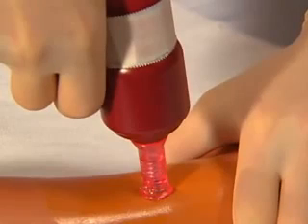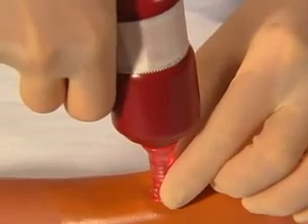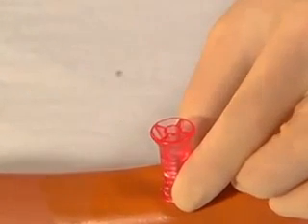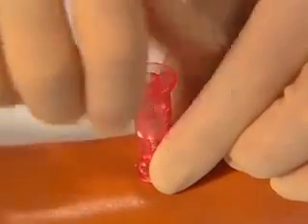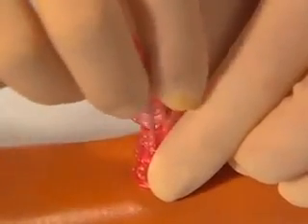Once resistance decreases, marking the entrance into the medullary cavity, take care to release the trigger and allow the driver to stop spinning before pulling back or disconnecting the needle. Gently hold the needle and pull the drill directly backward and off the needle to disconnect. Turn the stylet counterclockwise to unscrew it and gently remove it from the needle set.